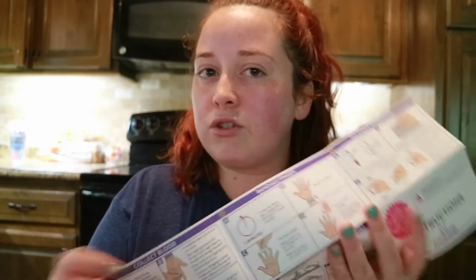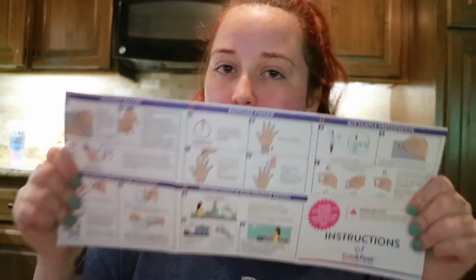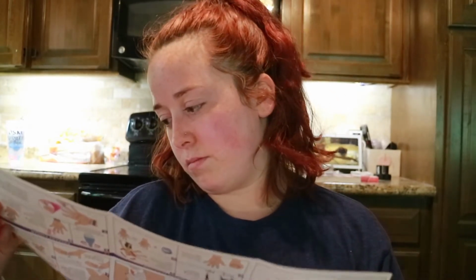The kit is active, so now it is connected to my information. So we are going to be opening up and moving all the stuff we don't need off to the side because we don't want to contaminate anything. So your instructions are here. I don't like how these instructions are. I wish it was more of a book, but I kind of get why. But it's also double-sided.